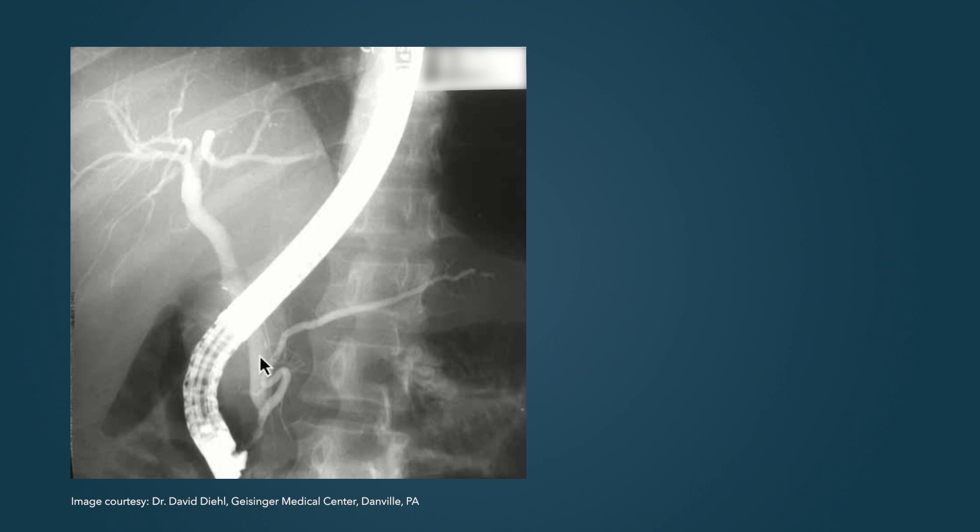The common bile duct has a vertical orientation going up to the liver where these intrahepatic ducts are seen. This point here is called the bifurcation in that there's the right and left systems bifurcating from the common hepatic duct.